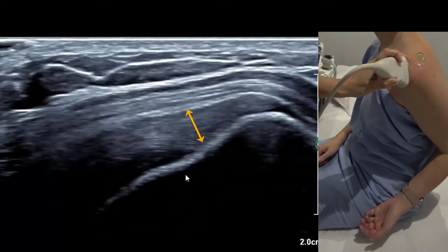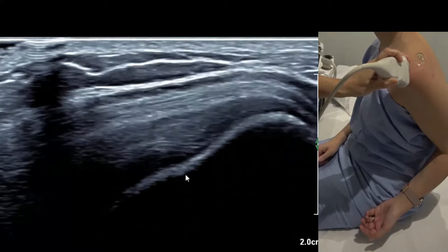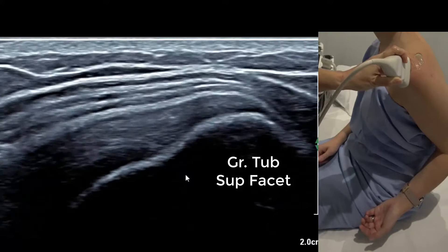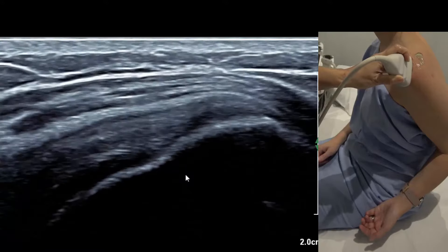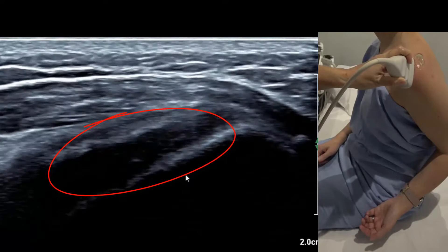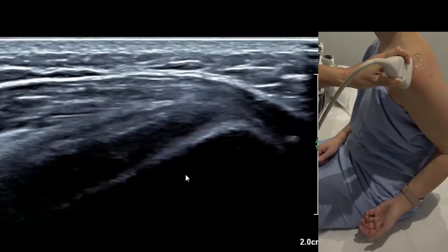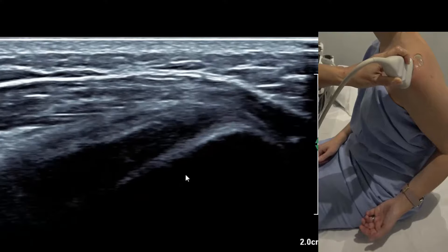Move back a little further — that's mid supraspinatus. A couple of millimetres more and we're on the posterior. If we go too far, we fall onto infraspinatus. The minute you see it change to a hypoechoic colour or look fluffy and ill-defined, you know you've gone too far and you're now on the middle facet.